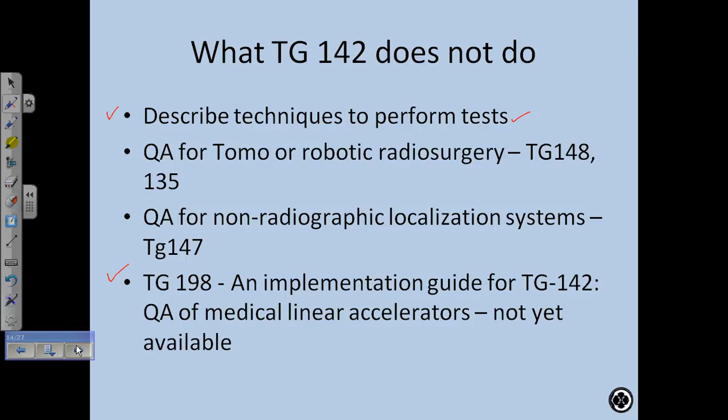I don't do every test that they have in there because I don't find them all relevant. But what I've done is I've taken those acceptance tests and I've correlated them to TG142. And so I've tried to match them up as best I could.